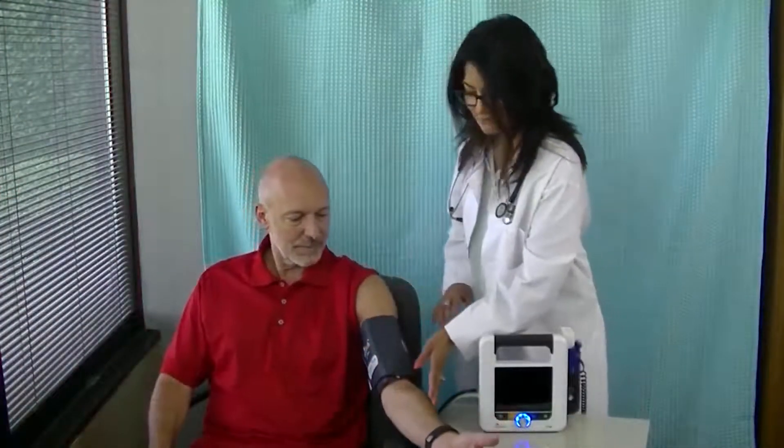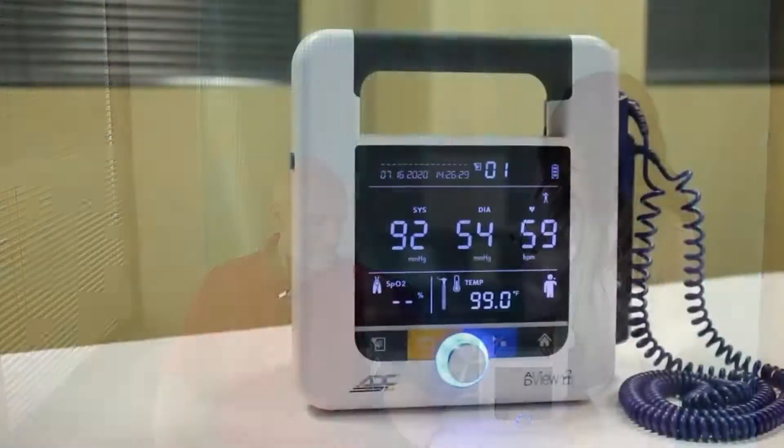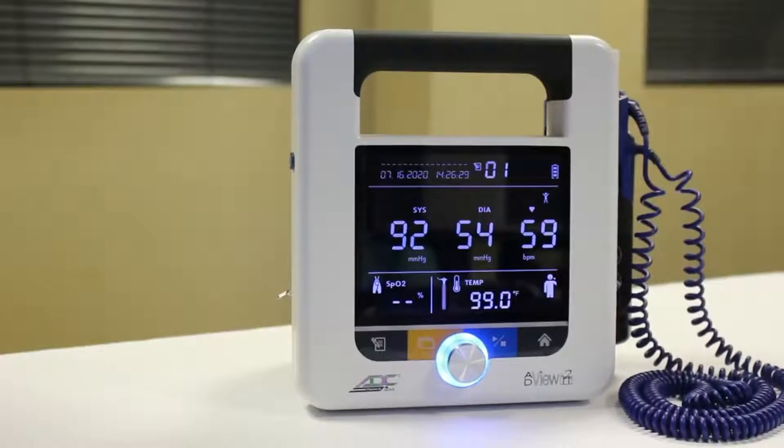With the cuff in place, press the Stop Start button. The cuff will begin inflating. When it reaches an appropriate pressure, it begins to deflate. The reading should appear in about 30 seconds.